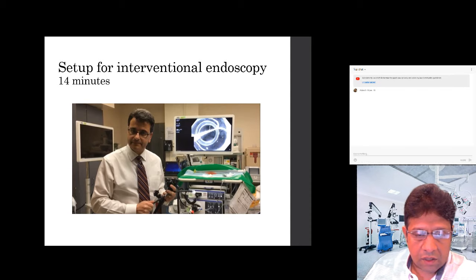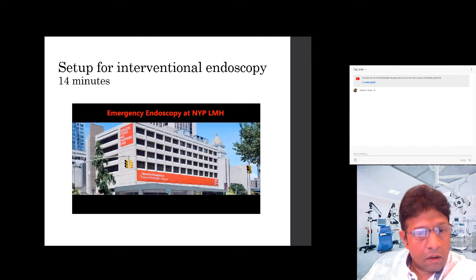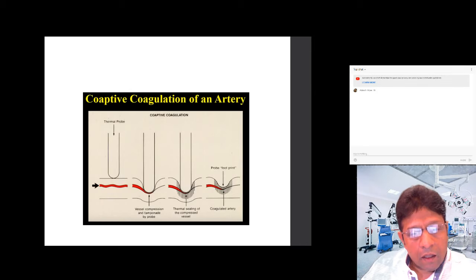Having said that, I personally still use a little bit of adrenaline because it seems to make sense. But apparently the theory is that just normal saline will work as well as adrenaline. And this is actually being tested in studies. Any other questions, please post.